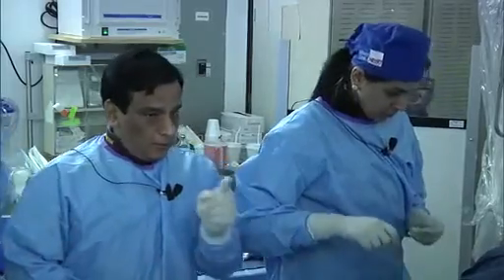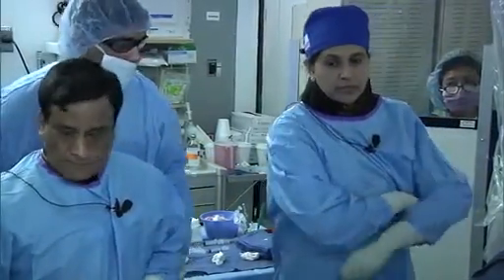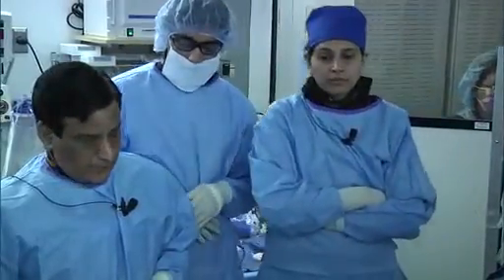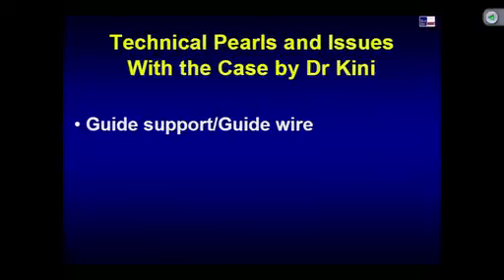Now, Anu, you want to go through your quick points, and then I'll go with the theory while you will be wiring this. You go ahead with your presentation. Good. Okay, Anu, here we go. Anu, back with you. Here is your slide.